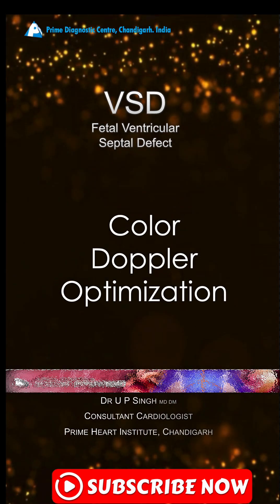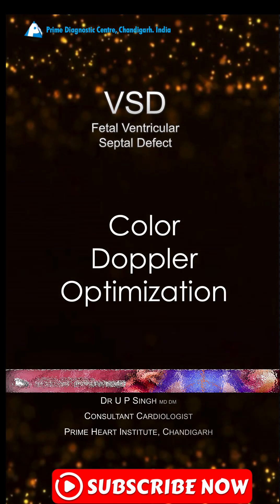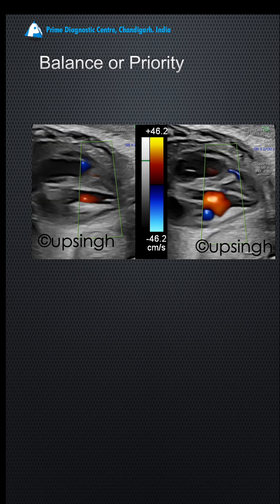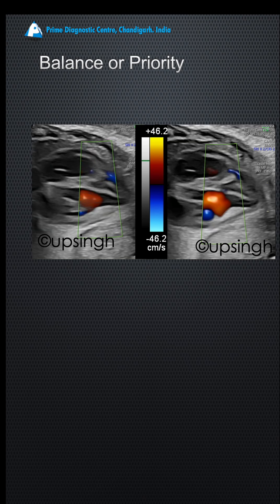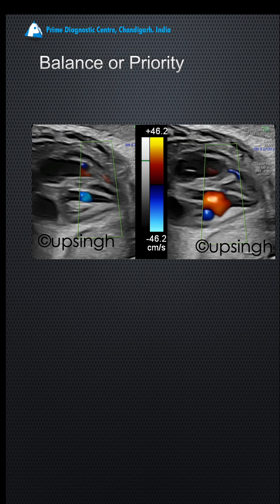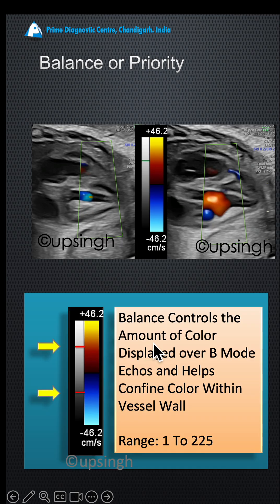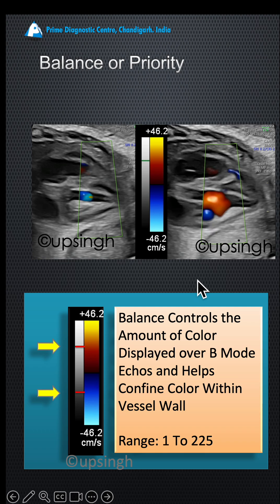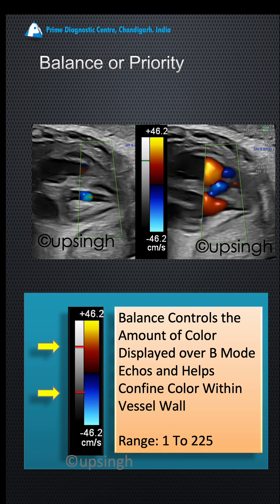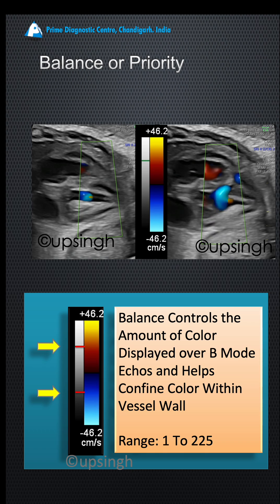Let's discuss how to optimize color Doppler to visualize a VSD. In this panel, you see 2D information and color Doppler, but the 2D information is dominating the VSD, so you don't see any VSD flow here. If your machine has a setting called 'balance,' you can give priority to either color Doppler or 2D — give priority to color Doppler over the 2D information.